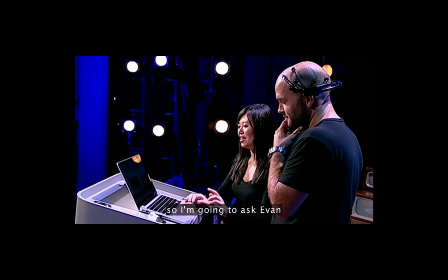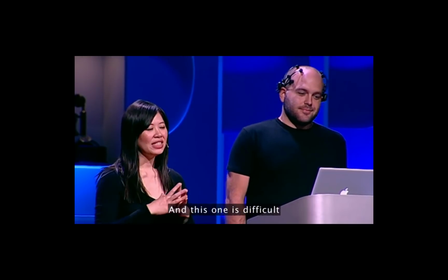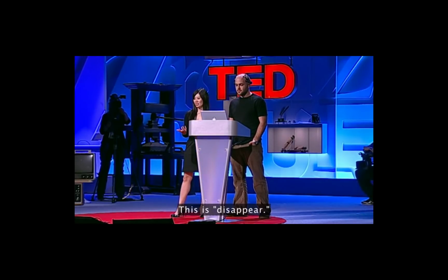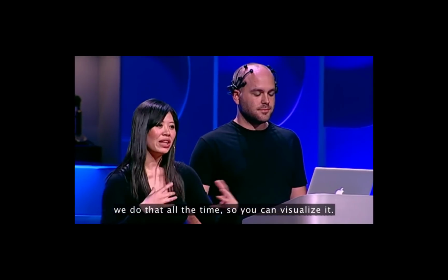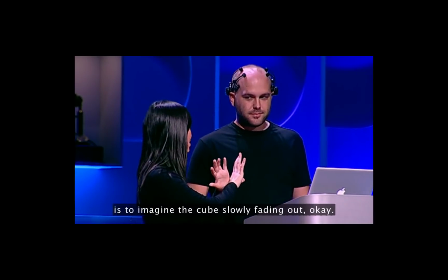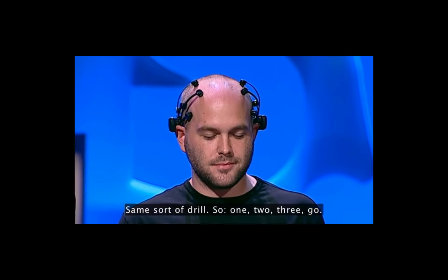So I'm going to ask Evan to do a really difficult task. And this one is difficult because it's all about being able to visualize something that doesn't exist in our physical world. And this is disappear. So what you want to do, at least with movement-based actions, we do that all the time, so you can visualize it. But with disappear, there's really no analogies. So Evan, what you want to do here is to imagine the cube slowly fading out, okay? Same sort of drill. So 1, 2, 3, go.